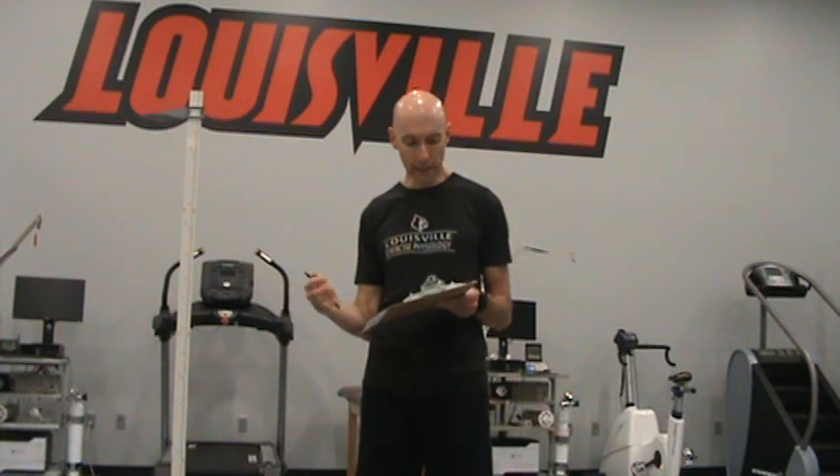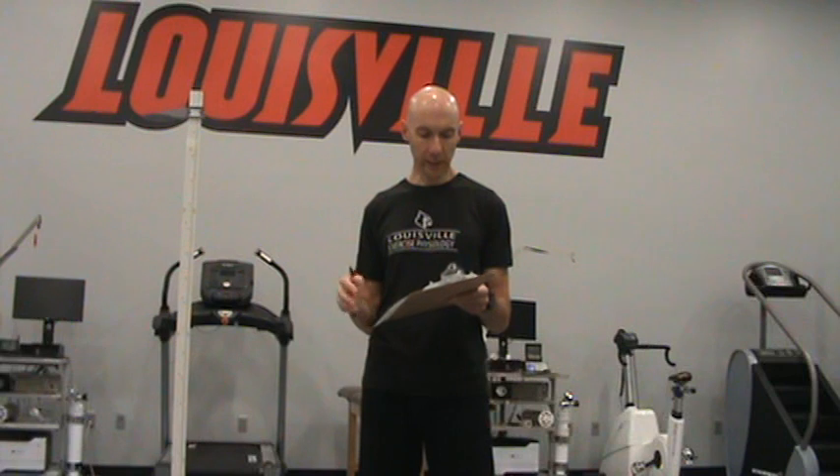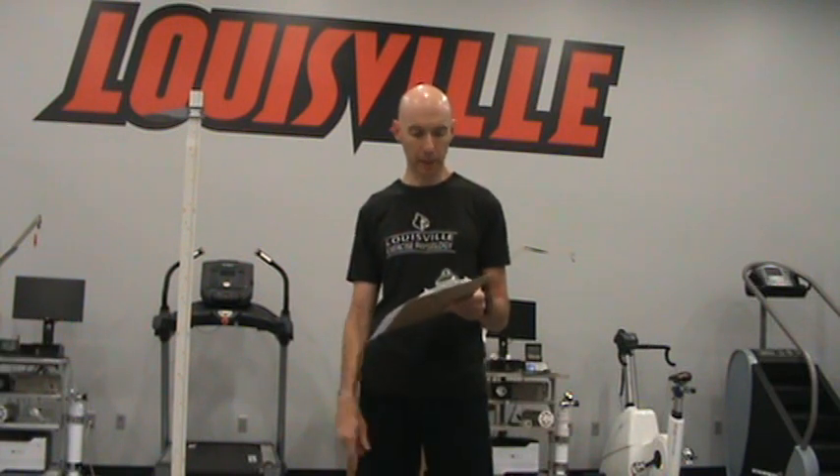Hello, today we are doing Lab One. This is anthropometric measurements, where we are going to learn how to take some basic measurements about external body dimensions on a subject. We are going to learn how to take height and weight, introduce the anthropometric tape measure, take waist and hip circumference measurements, and demonstrate how to use the nomogram found on the lab assignment.